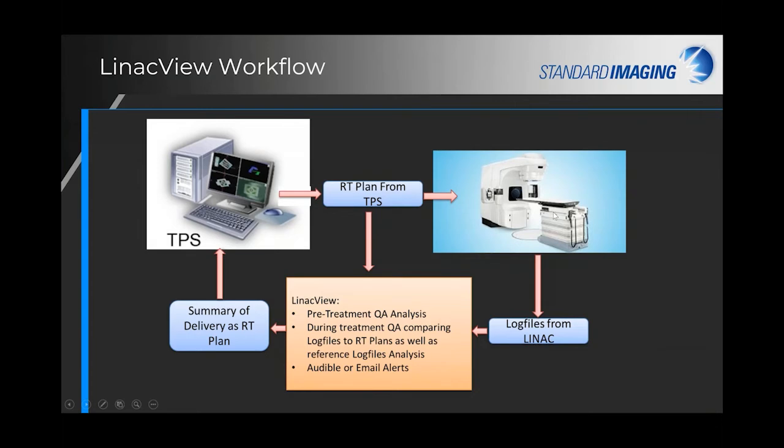And so let's begin. First I'll go through the LinacView workflow. Of course, you would begin by creating your plan in your treatment planning system. Once that's complete, you would export your RT plan from the TPS through to your record and verify system for delivery, and at the same time export to the LinacView console.